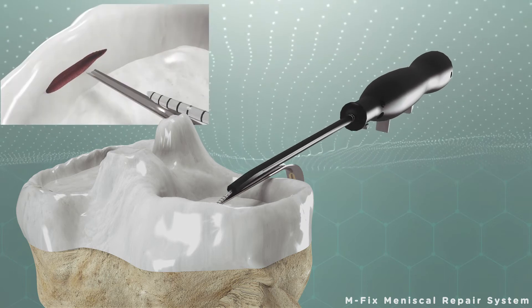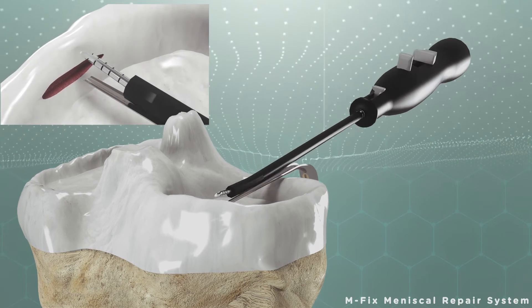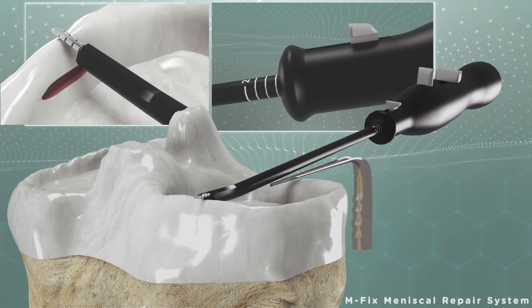With its user-friendly button on the M-FIX handle, the meniscus is measured with back and forth movements as per the measurement guide.